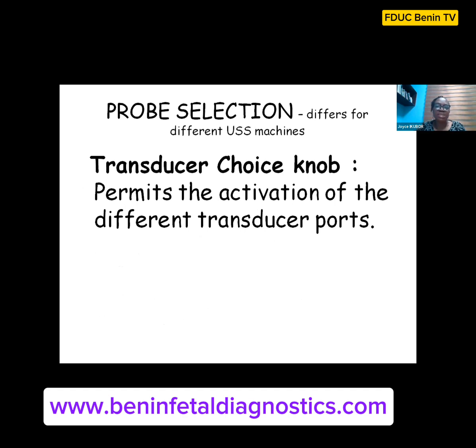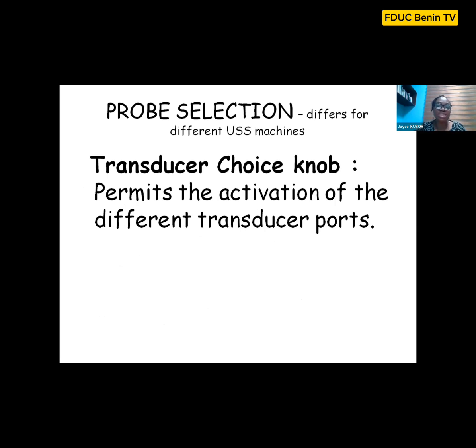Again, the transducer, there's a knob for this transducer. If you click on it, it will activate the particular transducer you want to use.